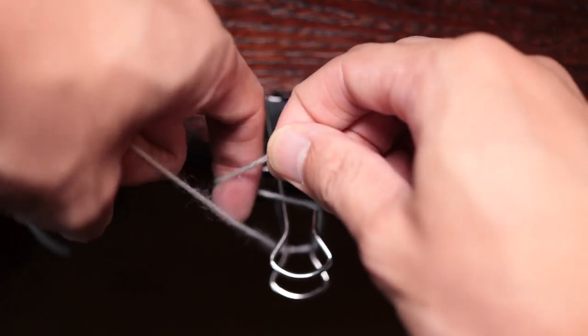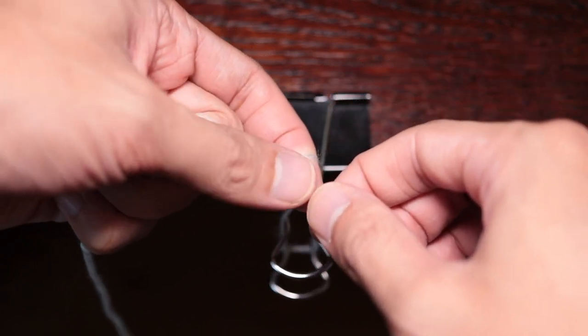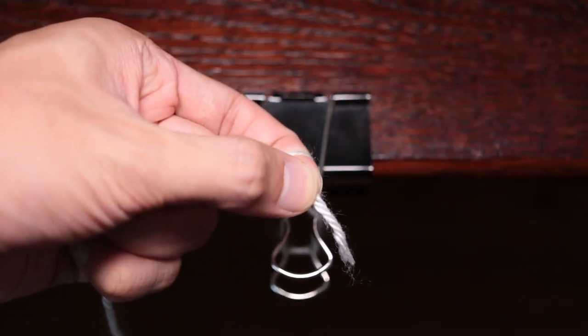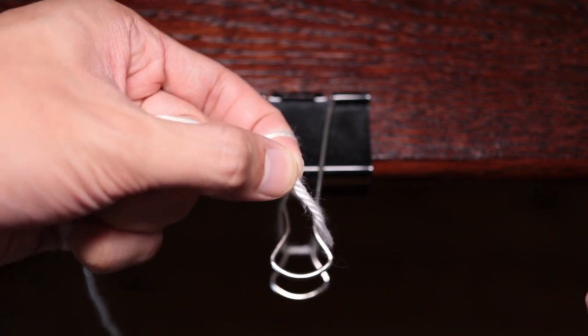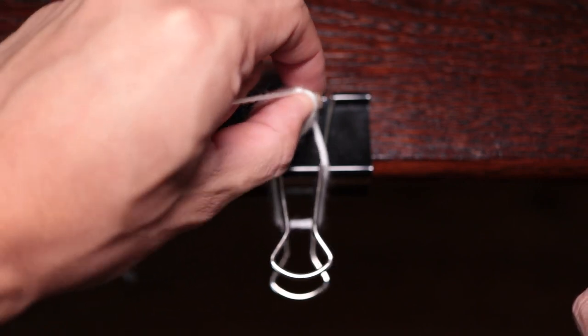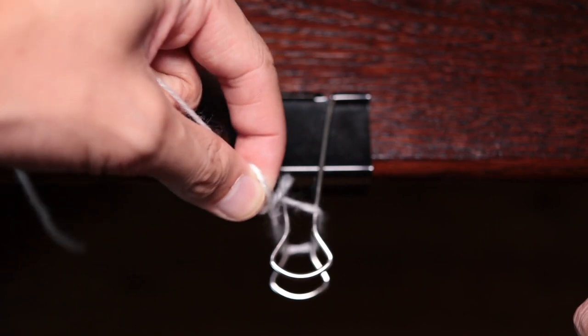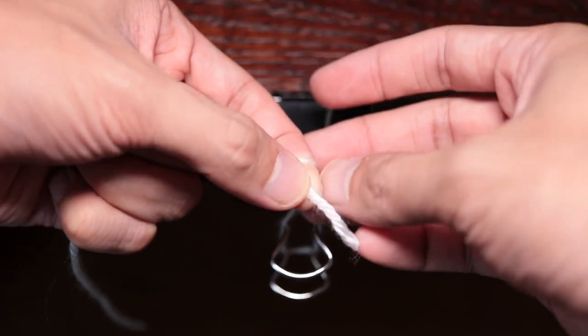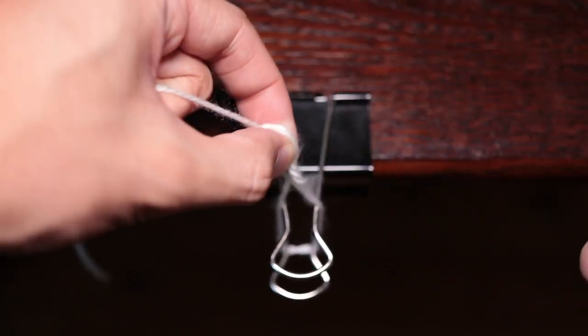After that, grab the free end between your thumb and index and pass it under. We'll go into more detail shortly; this is just a general overview of the move.